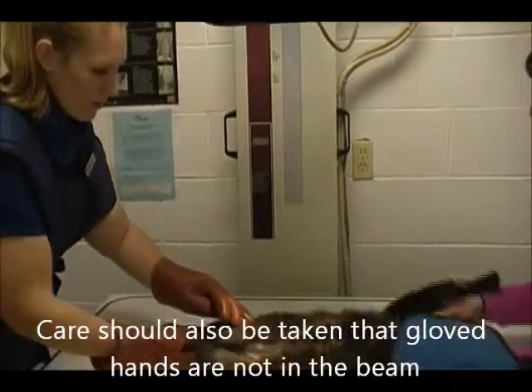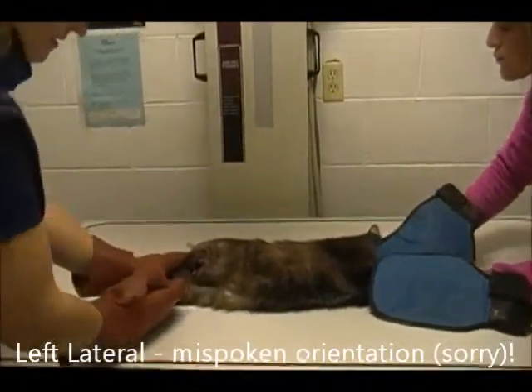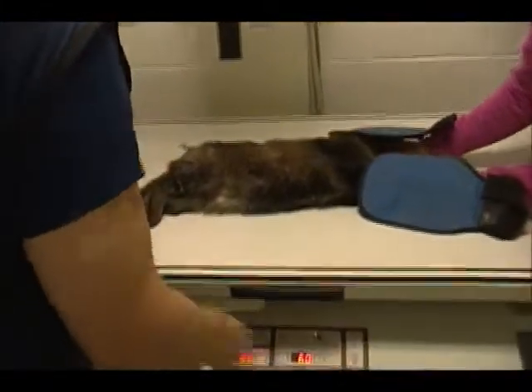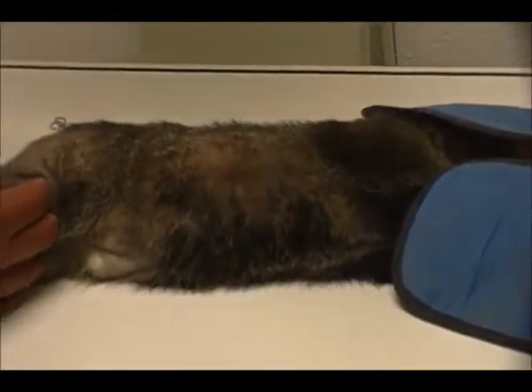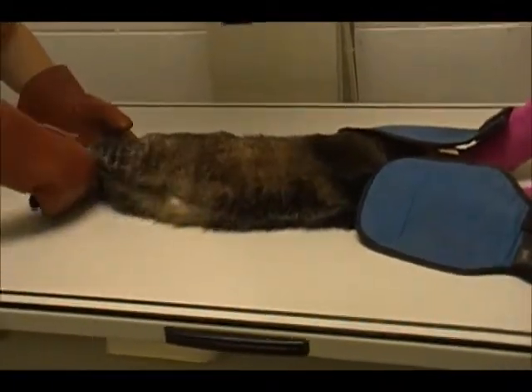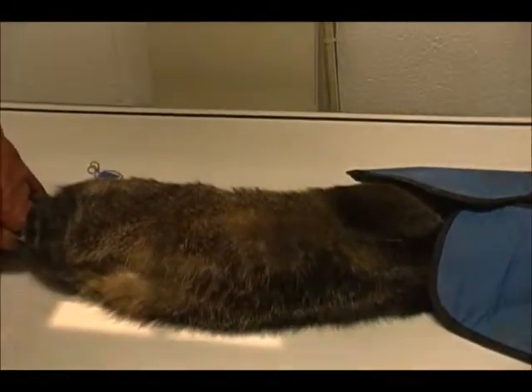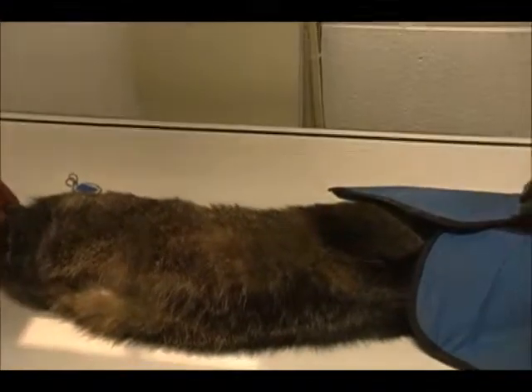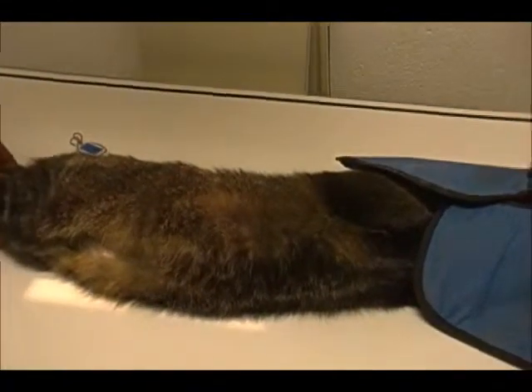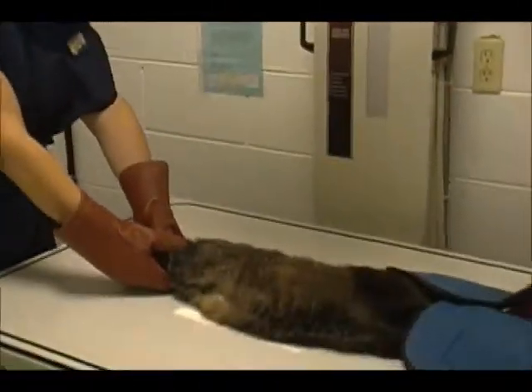And then for our lateral, we would turn him on his right lateral and center him here. We're going to change this now to 68 kVp and 6.0 mAs. We would also extend the hind limbs and the front limbs, and probably reduce the width of the collimation a little bit. We want to make sure that we don't have our gloves in the light whatsoever.